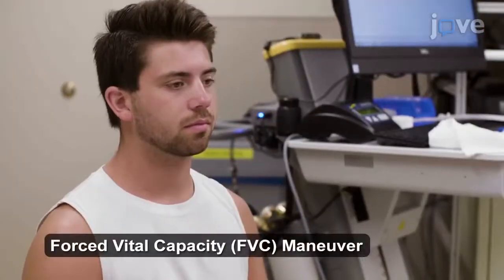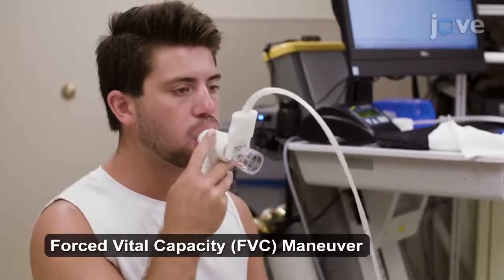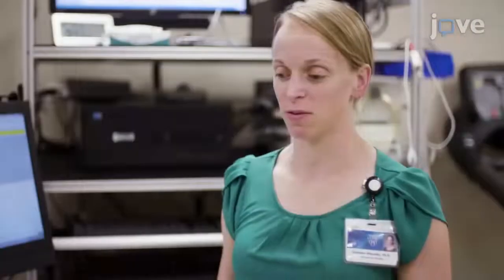For the forced vital capacity or FVC maneuver, instruct the subject to grasp the mouthpiece again while remaining in the same seated position. Start the maneuver on the software and instruct the subject to continue to breathe normally. Ensure the subject has established a stable breathing.